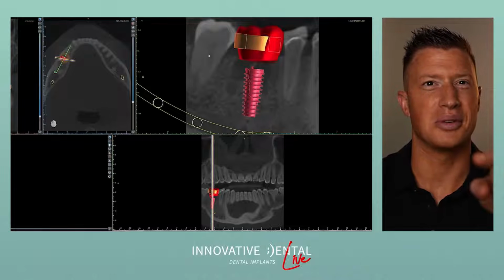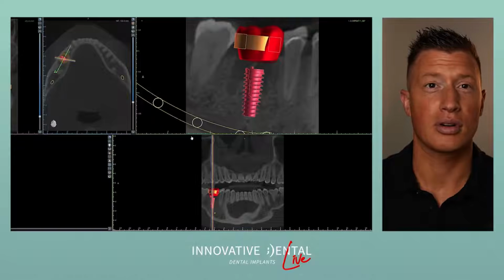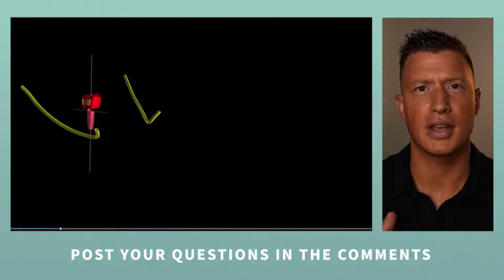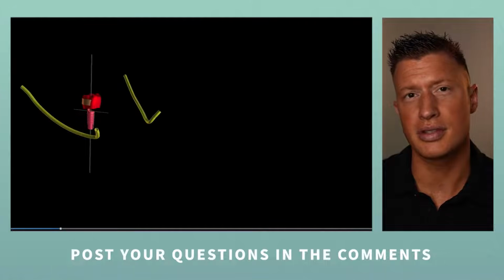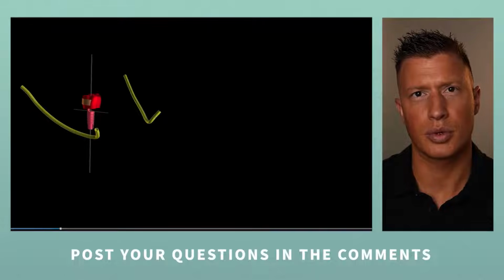Now you can really see that distal root, right, where the molar was. And we can see that we're a good 2-3 millimeters away from our nerve. So we know we're in a safe spot. There I am removing the bone so I could really see, hey, how close am I to the nerve with this implant? We're quite a ways away.